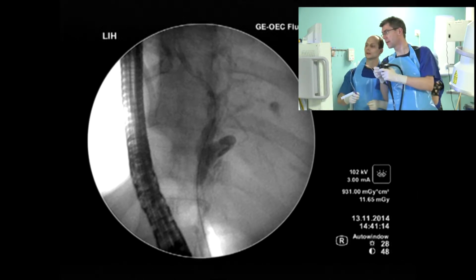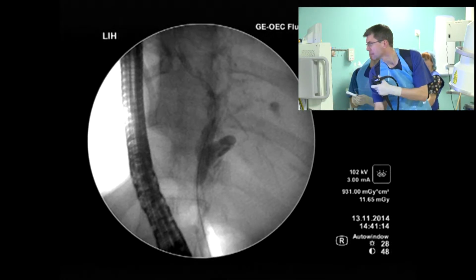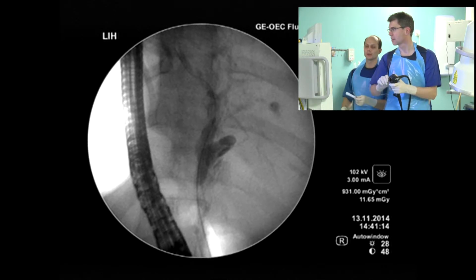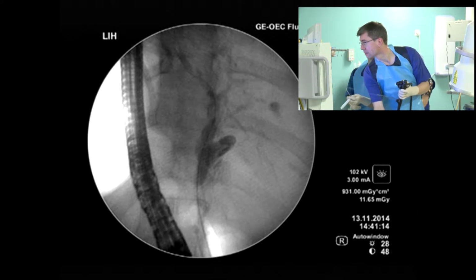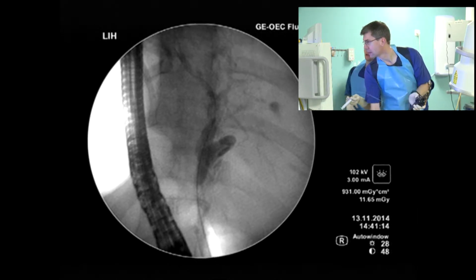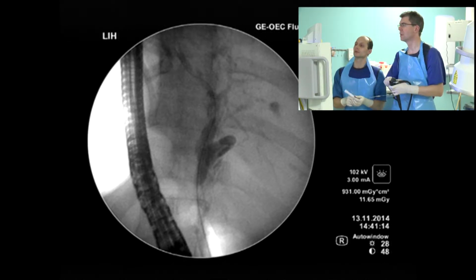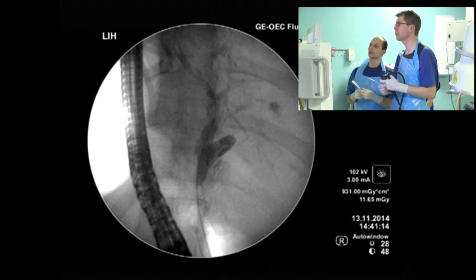Sorry about that. Regretfully, it is a very unstable position in the duodenum. Since the pressure with the catheter and guide wire was rather strong, we lost cannulation. We jumped back to the stomach. Alex will come back to the papilla and we will proceed. We'll repeat the procedure.